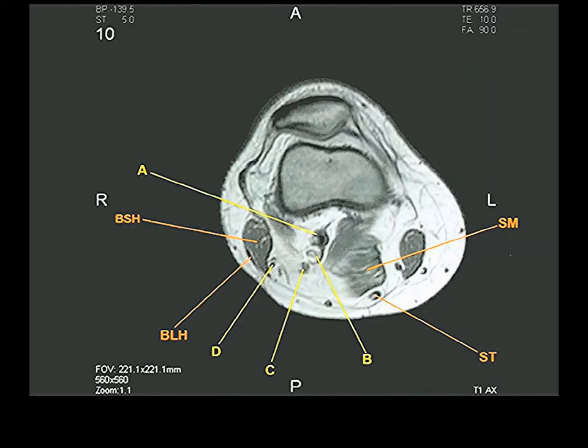This is based on a fixed relationship behind the distal end of the femur between three structures.